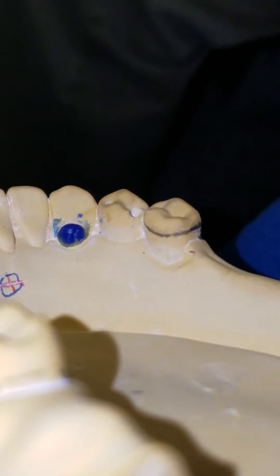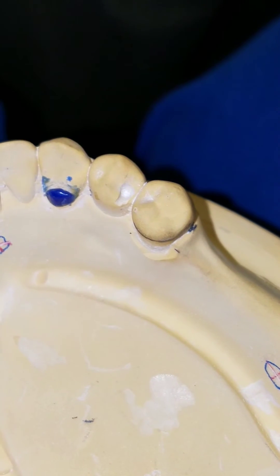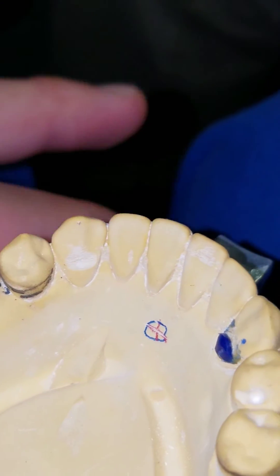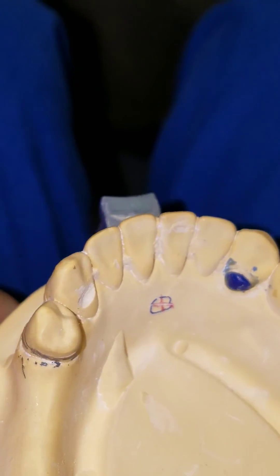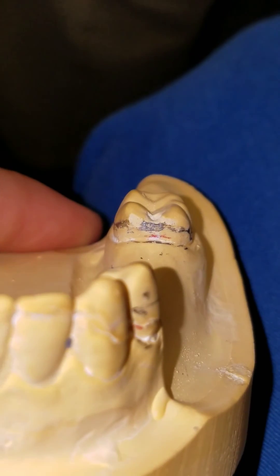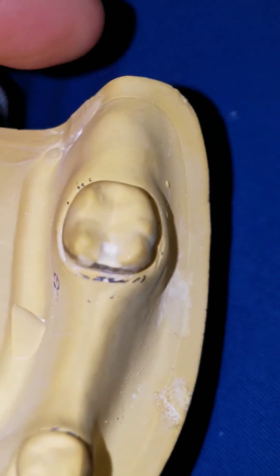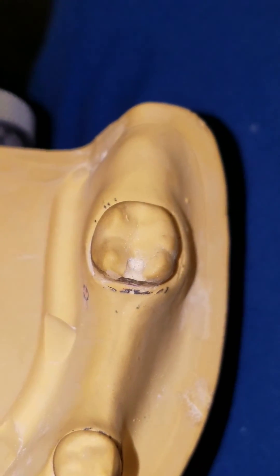One millimeter minimum. You could build the rest up a little bit further. Where do you decide how occlusal to keep it? Keep it in the cervical third — which basically means as low as you can. When we talk about gingival, middle, and occlusal: occlusal means keep it as high as you can; gingival third means keep it as low as you can.